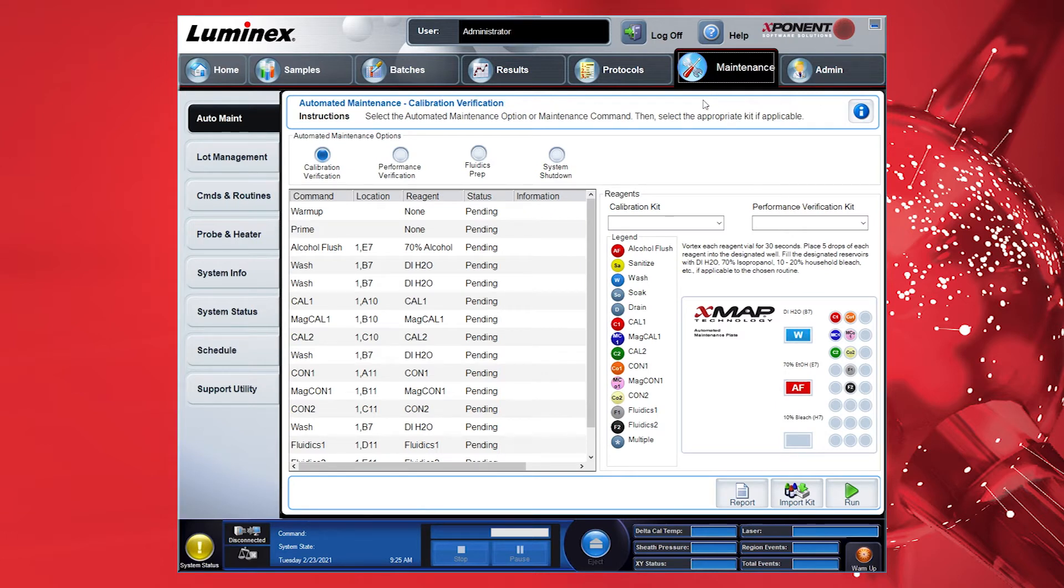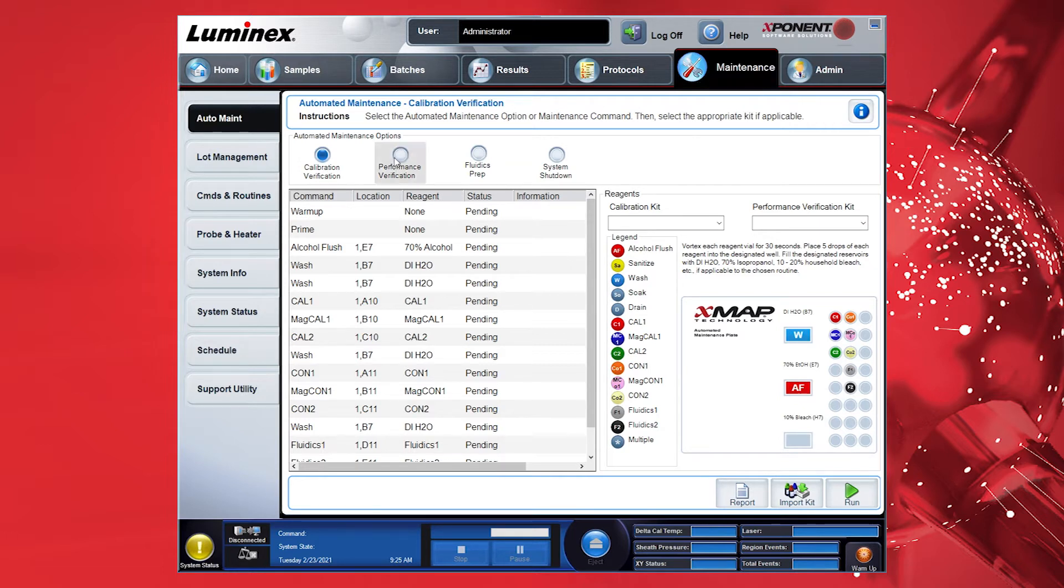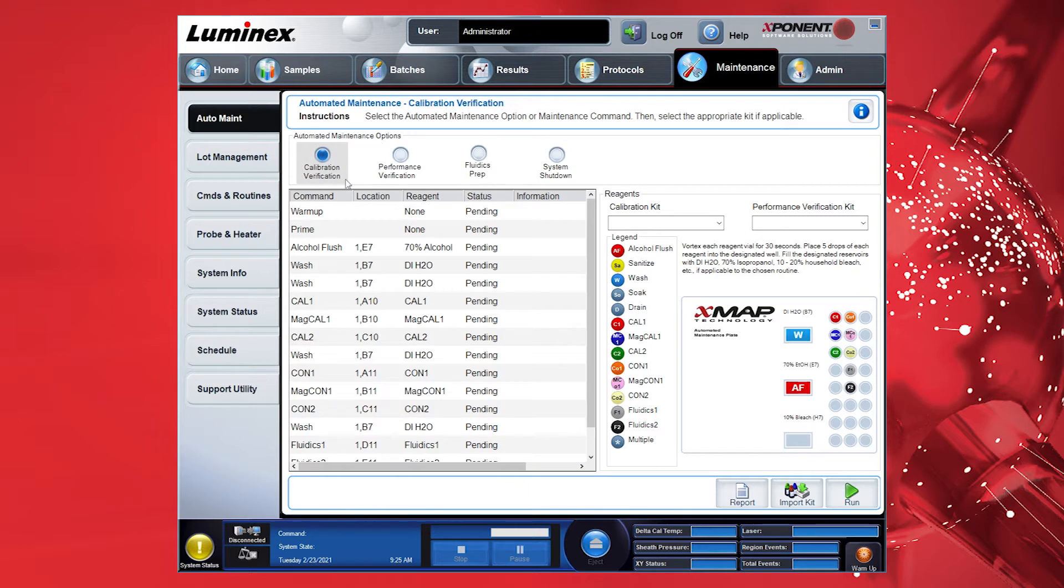Refer to the Maintenance tab to ensure that the instrument is properly calibrated and verified using the necessary startup calibration and verification procedures by following the system initialization process as outlined by the Luminex Instrument User Guide.